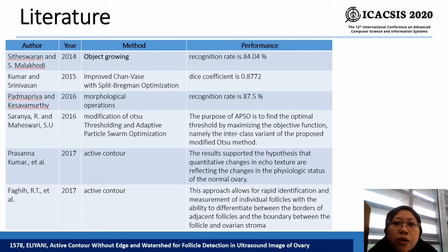Performance: Dice coefficient is 0.8772. Padmapriya and Kesavamurthy using morphological operation. Performance: recognition rate is 87.5%.